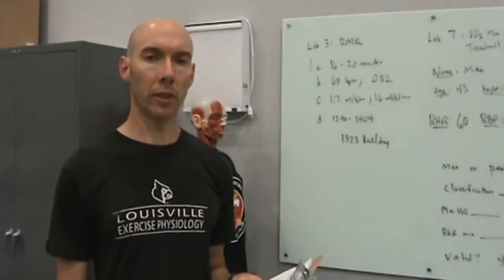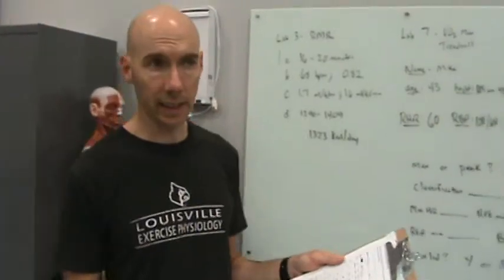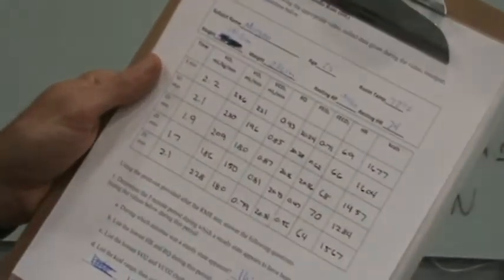Okay, we're back with the results from the resting metabolic rate test. During the test, we record the data on the lab assignment at the end of every 5-minute interval. So is that pretty clear? You all might want to just pause the video right now and write down all of these numbers. We'll fill these in here in just a second. And notice that we did do a full 25 minutes with Morgan.